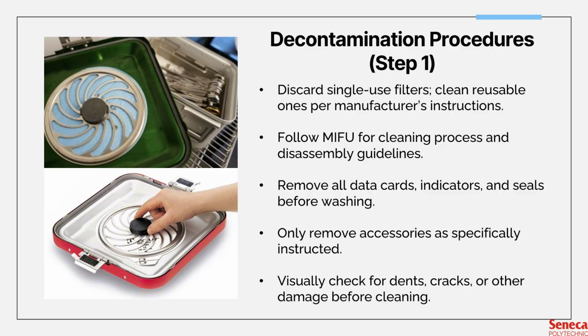You always discard single-use filters, and a single-use filter is usually this blue colored filter that goes inside this filter holding mechanism. And of course, there are reusable filters. You would have to clean the reusable filters too, make sure they're free of blood and debris. But I would rather say it's reposable rather than reusable, because it does get replaced and disposed of after a certain amount of uses.